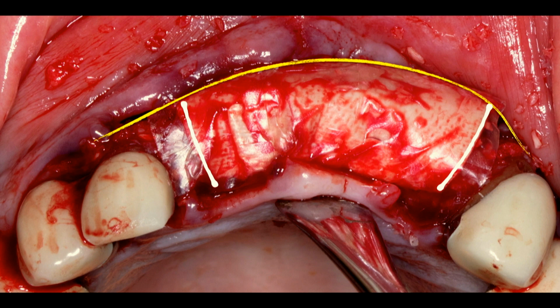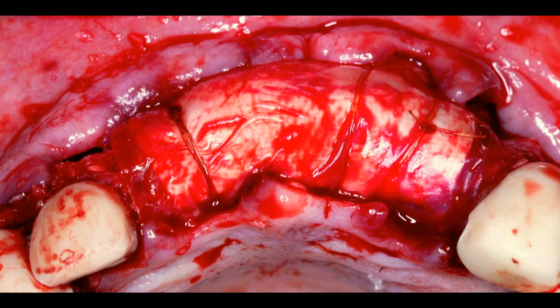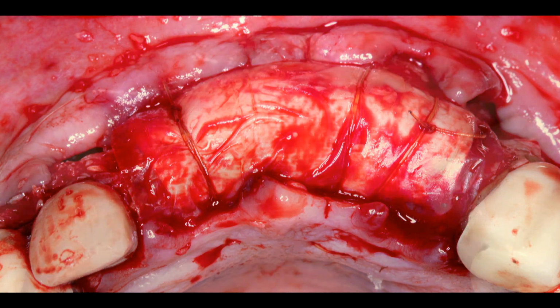And again, you can see just that gross amount of overbuilding that I did here. And then I was able to use stabilizing sutures. Now, you can use stabilizing sutures without the collagen membrane, but because of the handling properties of this membrane, you can sort of put too much pressure in certain areas. So the collagen membrane definitely helped here.